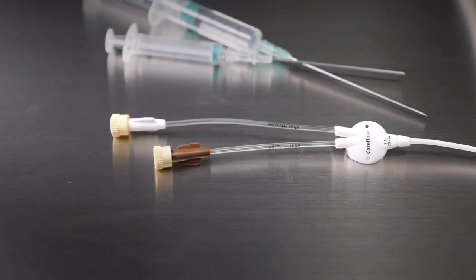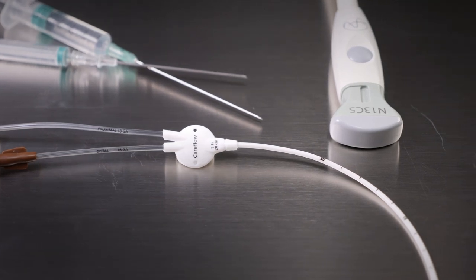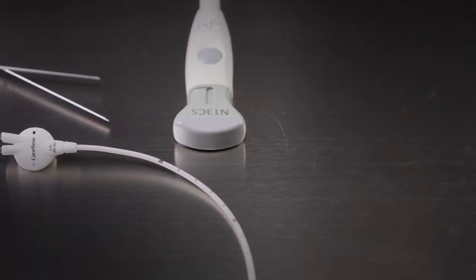Subclavian central venous access using a micro convex probe has several advantages, and this video is a demonstration of our preferred technique.